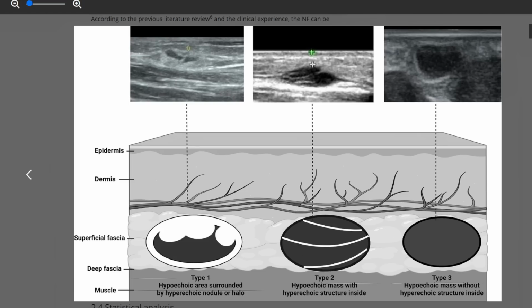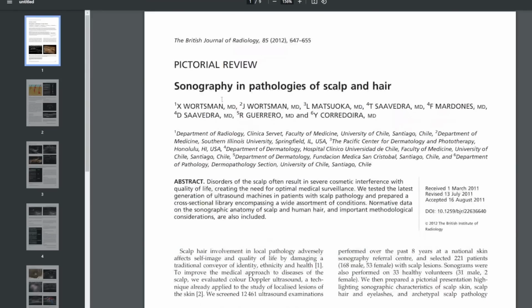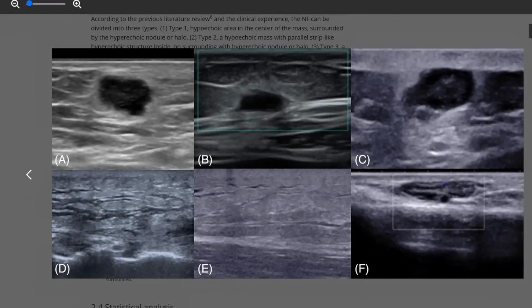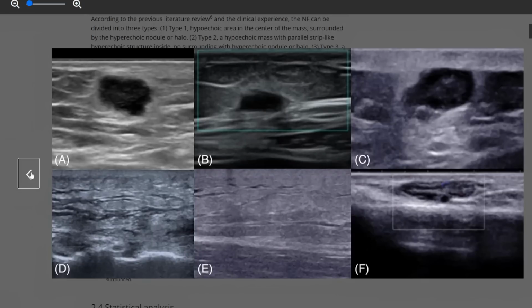And I think that's pretty apropos to what we're talking about here in this particular study that concerns sonography of pathologies in the scalp, right? Two different conditions: fasciitis involving the foot, and pathologies of the scalp and the hair. But it's still, nevertheless, interesting to make that learning connection here, where all we're trying to focus on at this point in time is learning what hypoechoicity is.